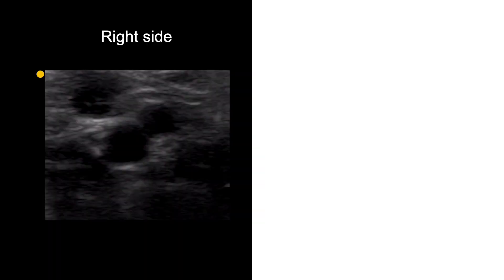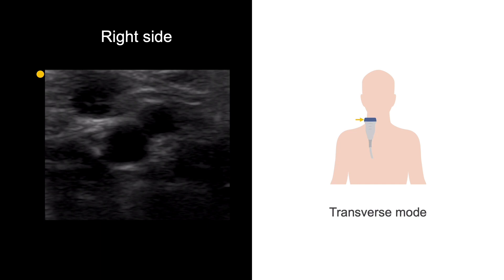Remember that the probe marker at the top left of the image should always represent the right side of the patient when imaging the carotid arteries in the transverse mode. So when imaging the right side of the neck, the larger, deeper artery on the left side of the image — that is the lateral side of the neck — is the ICA.